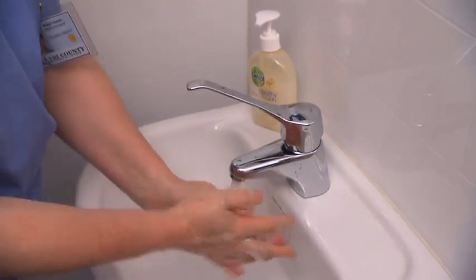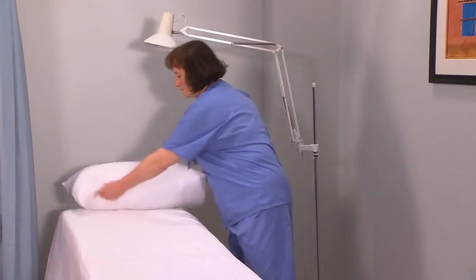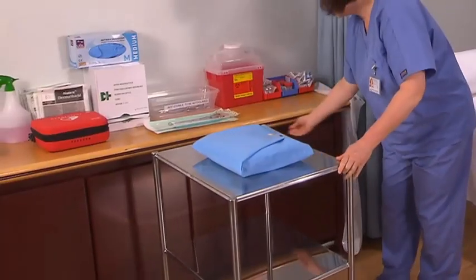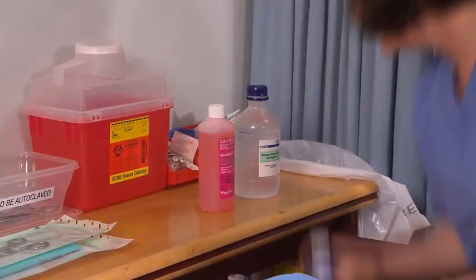Wash your hands. Begin by ensuring that the surgery room is warm, well-lit and private. Consider the appropriate placement of any equipment that will be required during the procedure.